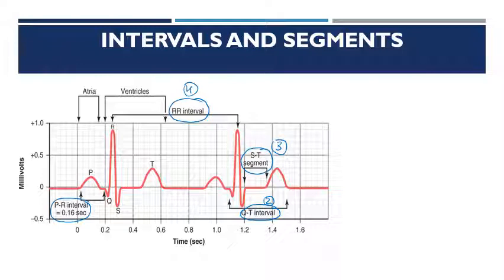We will discuss these intervals and segments one by one in the next coming slides.